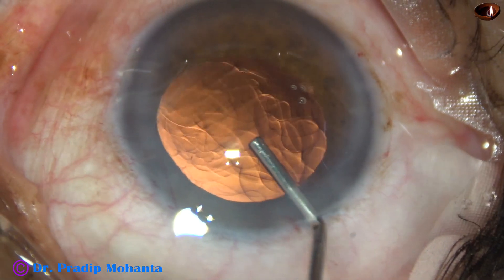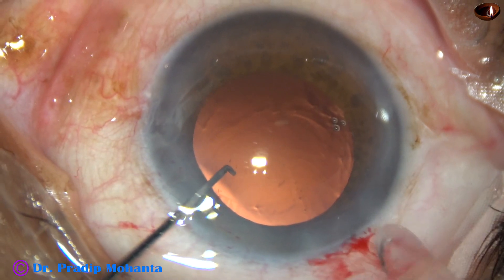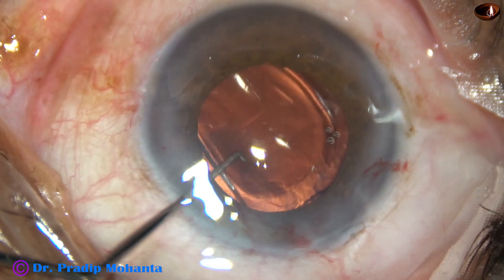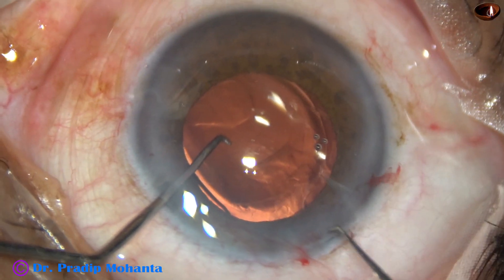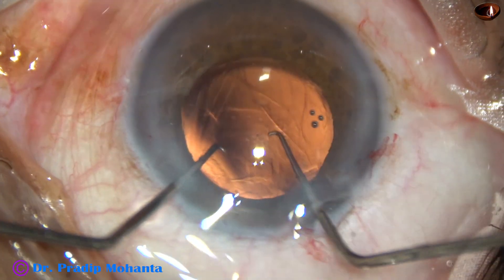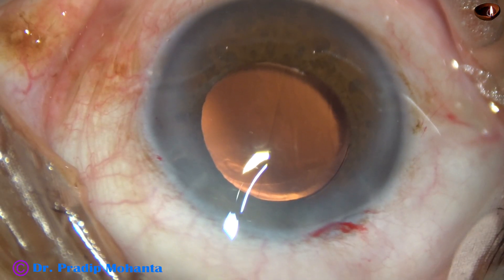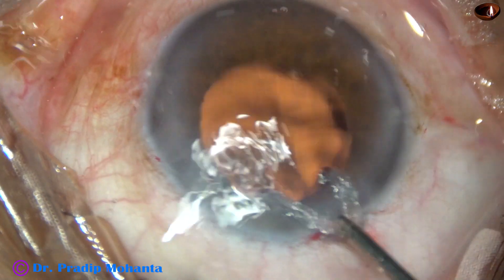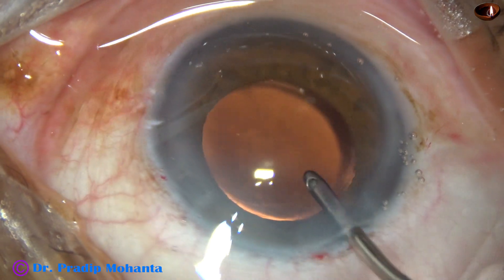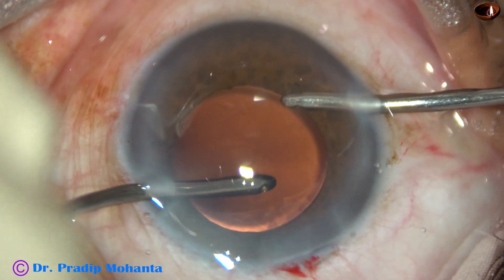And now this is visco, and this is a monofocal single-piece intraocular lens. The lens is implanted in the capsular bag. So the lens is placed in the capsular bag. The haptics are about 90 degrees away from the main incision. And now the visco that is there in the anterior chamber and the capsular bag is nicely removed by bimanual irrigation aspiration.